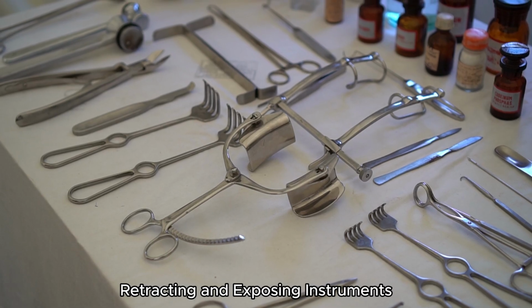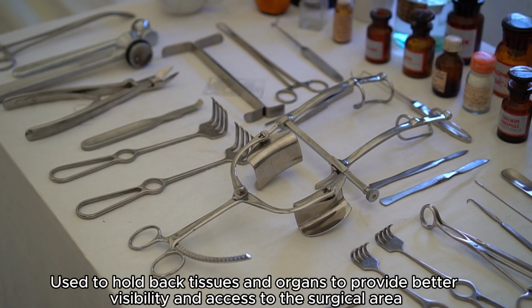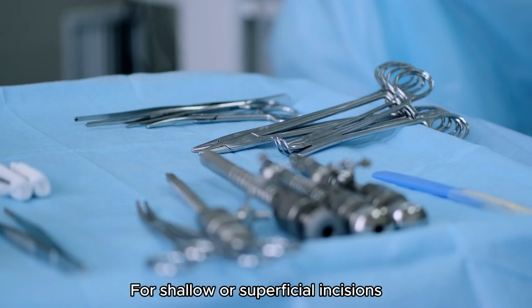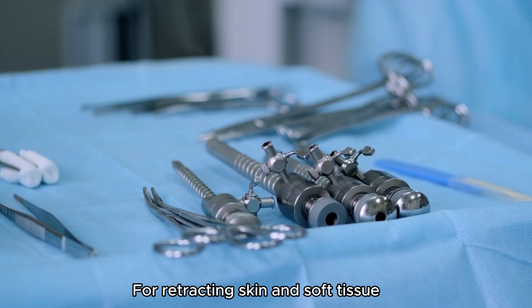Retracting and exposing instruments. Retractors, used to hold back tissues and organs to provide better visibility and access to the surgical area. Army-Navy retractors, for shallow or superficial incisions. Senn retractors, for retracting skin and soft tissue.